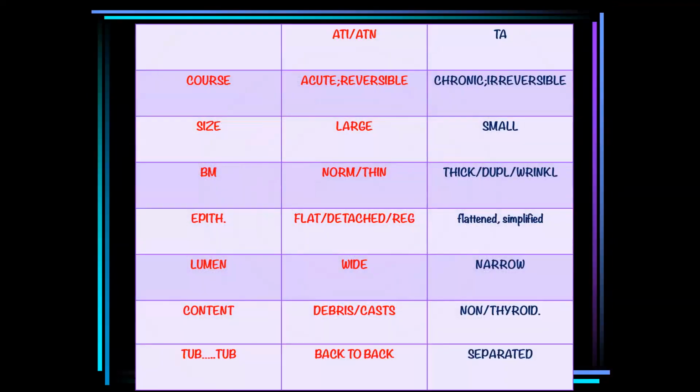As we discussed, for renal tubular atrophy on one hand, and acute tubular injury together with acute tubular necrosis on the other, this table will help differentiate between the two conditions. This is an acute, reversible problem, but this is a chronic, irreversible problem. Usually the size of the renal tubules is large, but here it is small. The basement membrane is of normal thickness or maybe thin, but in tubular atrophy, the renal tubular basement membrane may be thick, wrinkled, or duplicated, and in the endocrinization form, it may be thin.